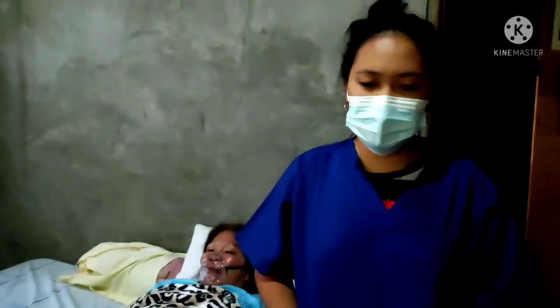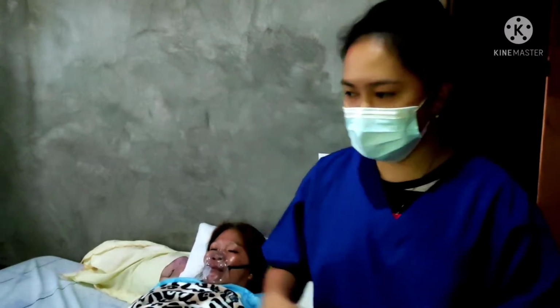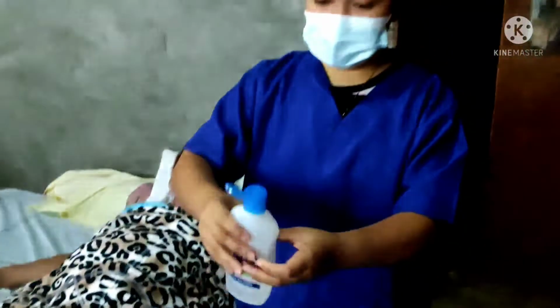So now I'm performing nasopharyngeal suctioning. Before performing nasotracheal suctioning, make sure the patient has no contraindication to the procedure, such as bleeding disorder, epiglottitis, or laryngospasm. Perform hand hygiene to prevent spread of infection. Ensure privacy to maintain privacy.